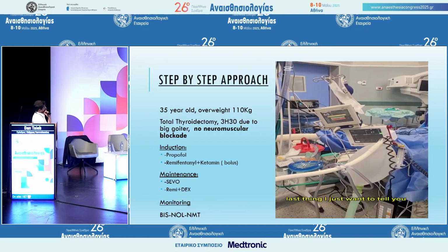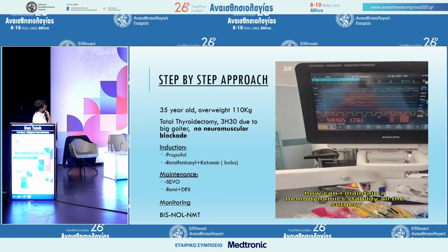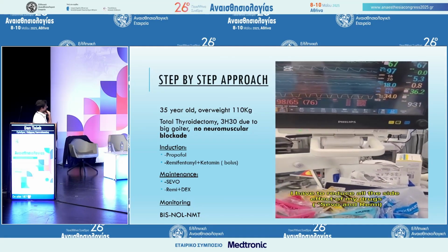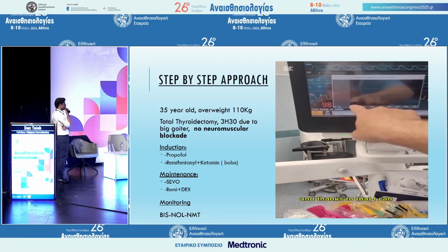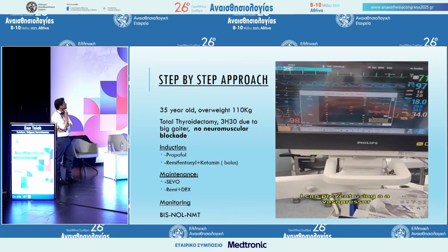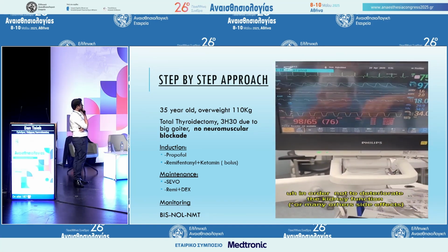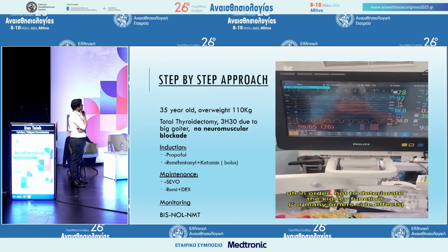Last thing I just want to tell you, how can I remain in hemodynamic stability during all the surgery? I have to reduce all the secondary effects of my drugs, and thanks to that, I can prevent using vasopressor in order not to deteriorate my kidney function.